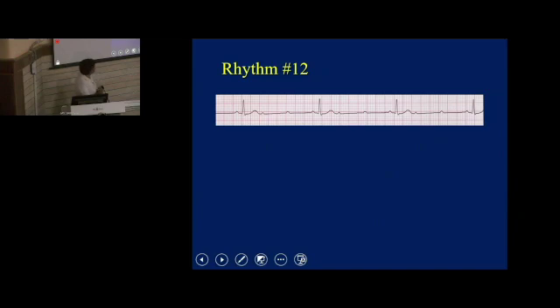You see, this P wave is followed by a QRS complex. So normal, it is conducted. This P wave is not conducted. Do you recognize this is a P wave? This is one complete cardiac cycle, P QRS T. Again the P wave comes, but there is no QRS complex. Again the P wave comes, there is no QRS complex. Again the P wave comes, but there is a QRS complex. Again this P wave is not conducted, this one is not conducted, this one is conducted. This is not conducted, this is not conducted, this one is conducted.